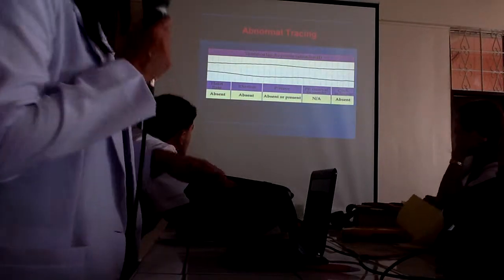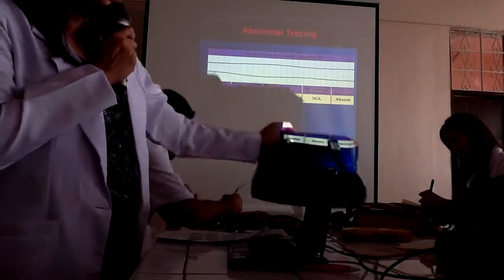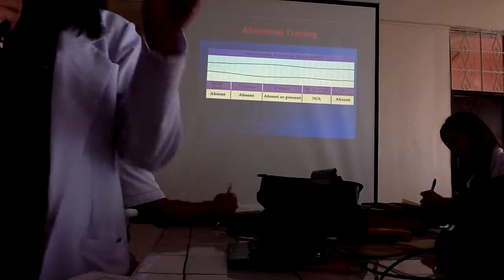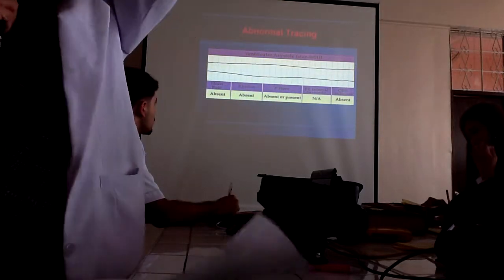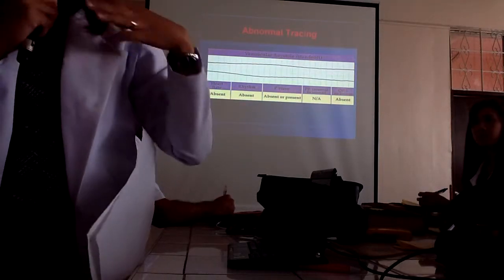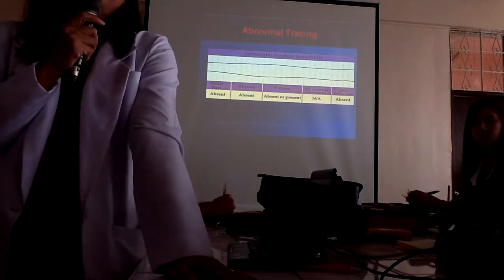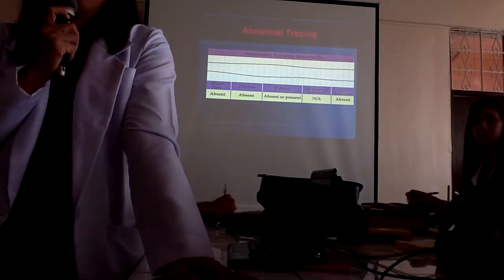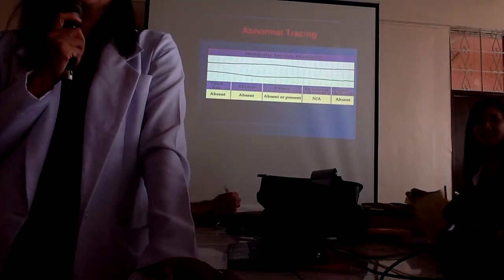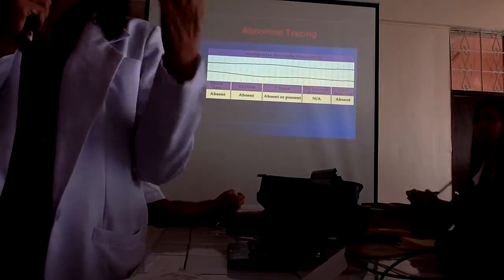Okay? So any questions? I'm going to distribute certain ECGs so we can work on that. Group 1, 2, and 3, you can go to the last room. Choose one member from your group to have an ECG. Unfortunately, because of the setup, it's not ideal. So we have to have a male volunteer for this, not females, because females have to remove your upper blouse. So that's not allowed. Okay? Because of the setup, you can only do the males.